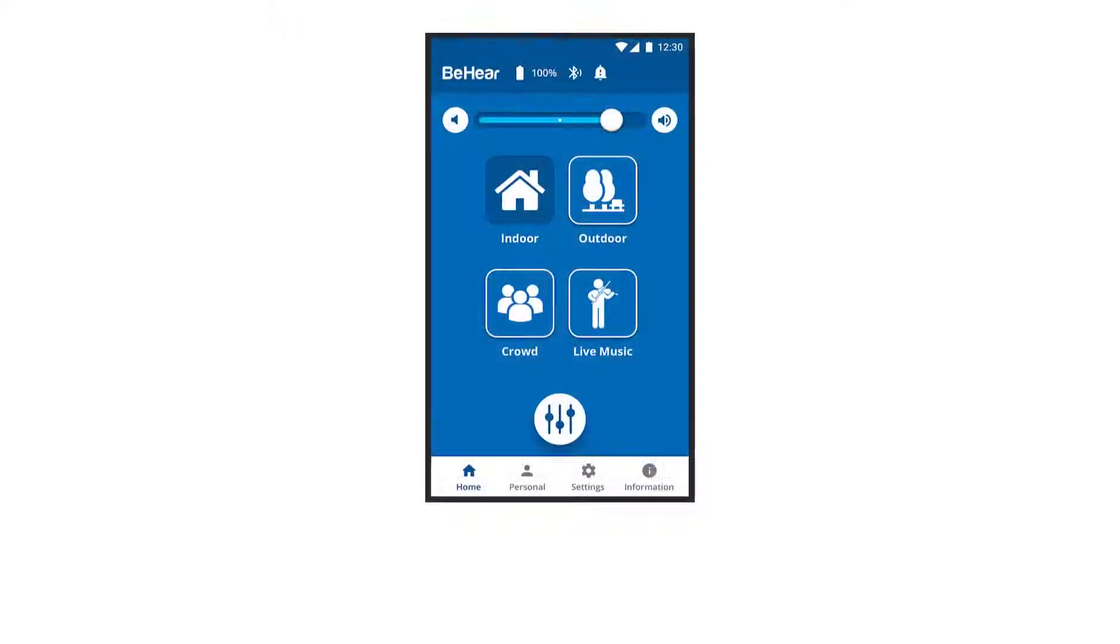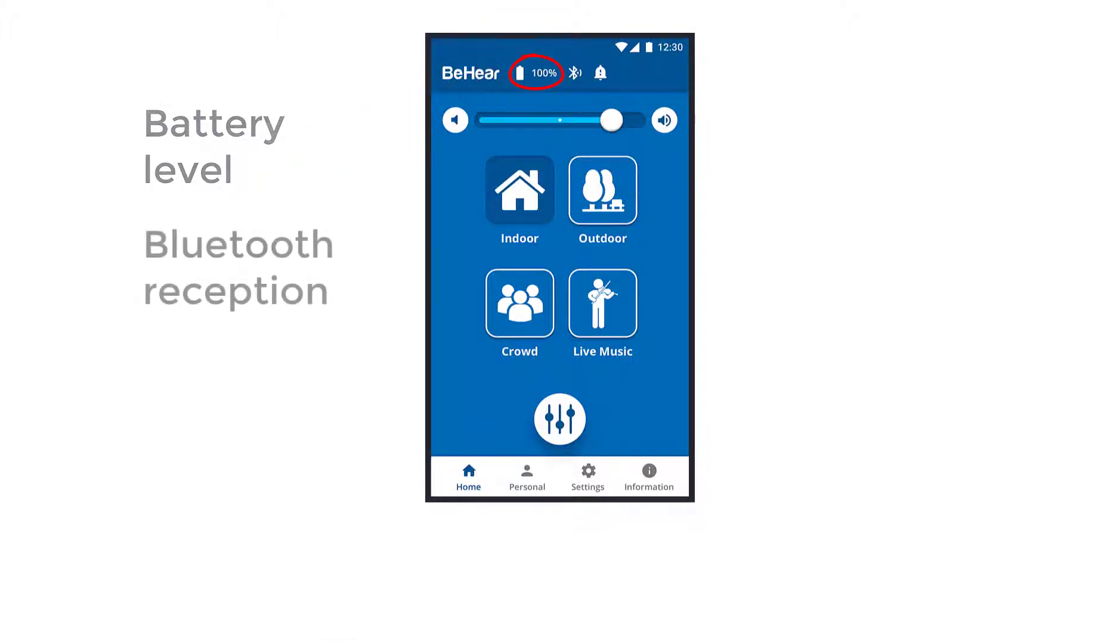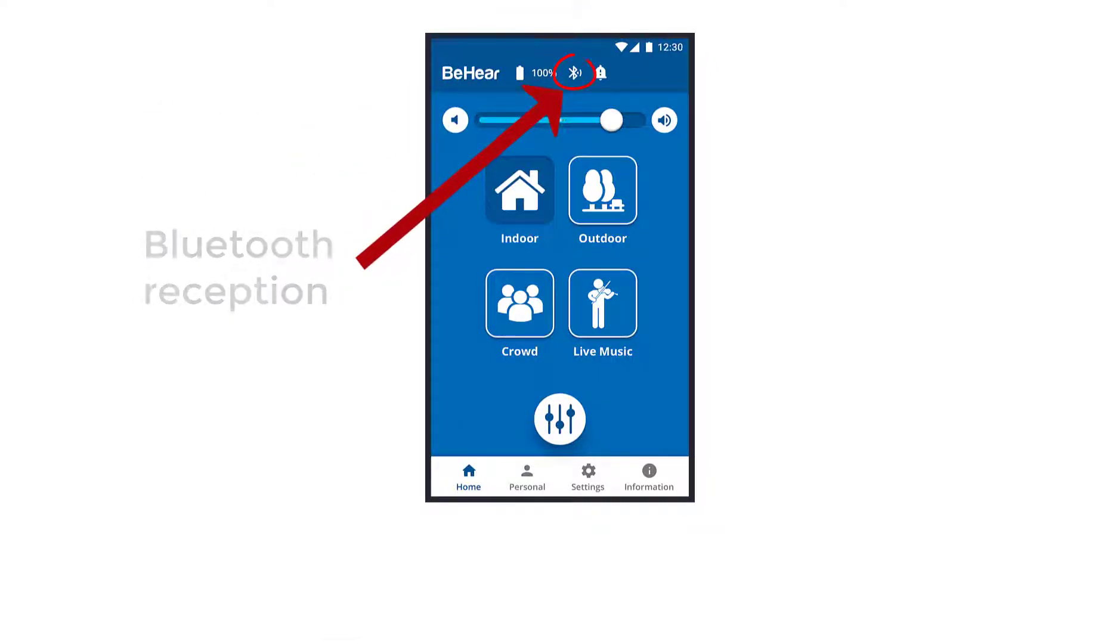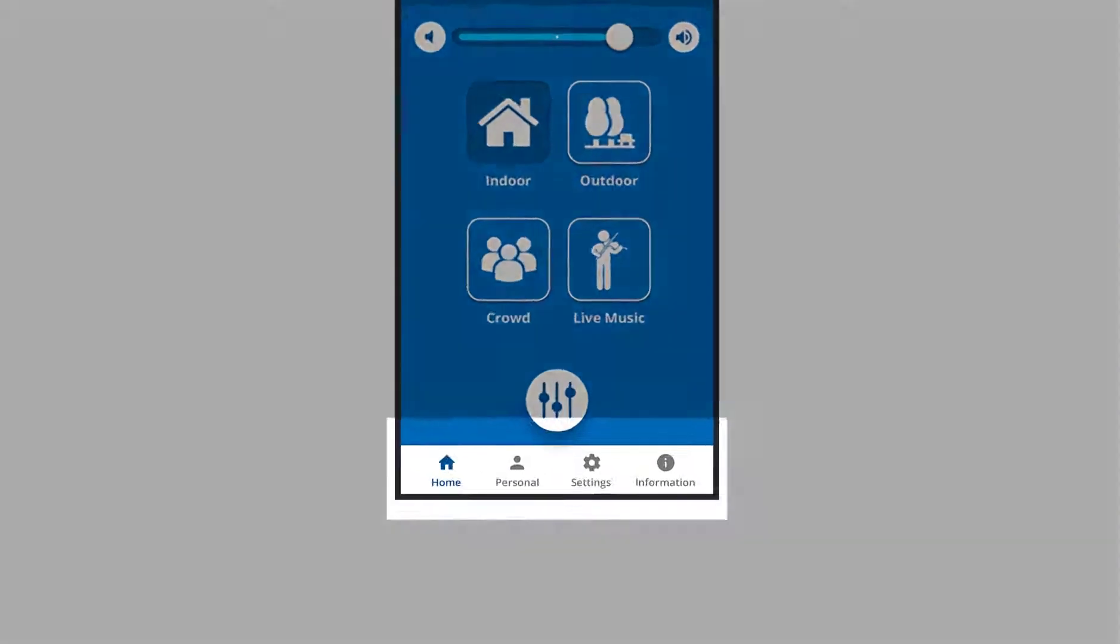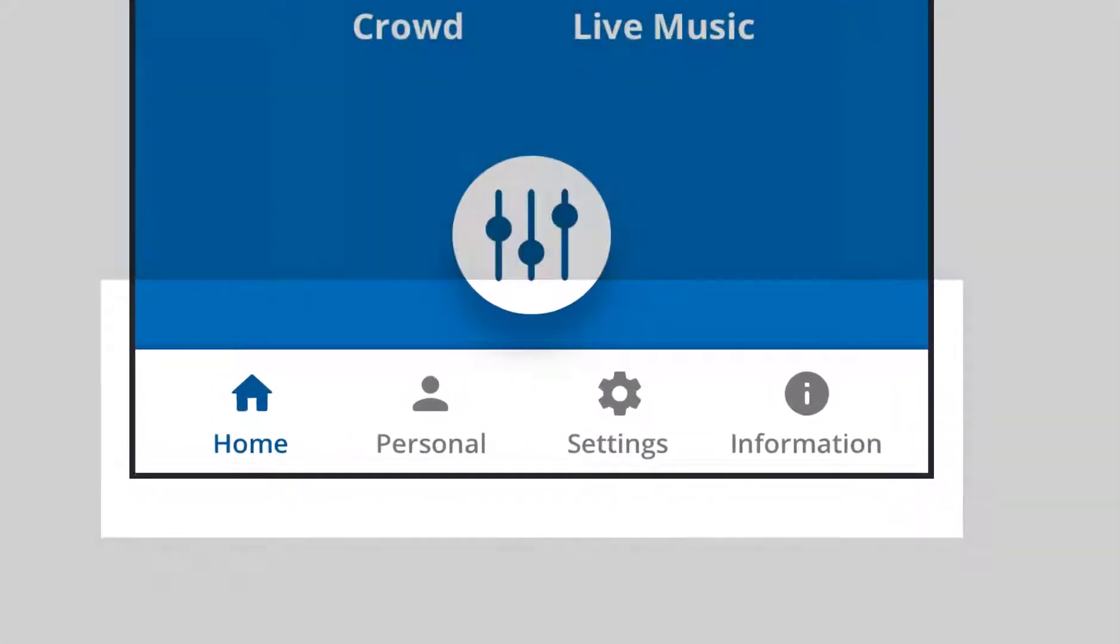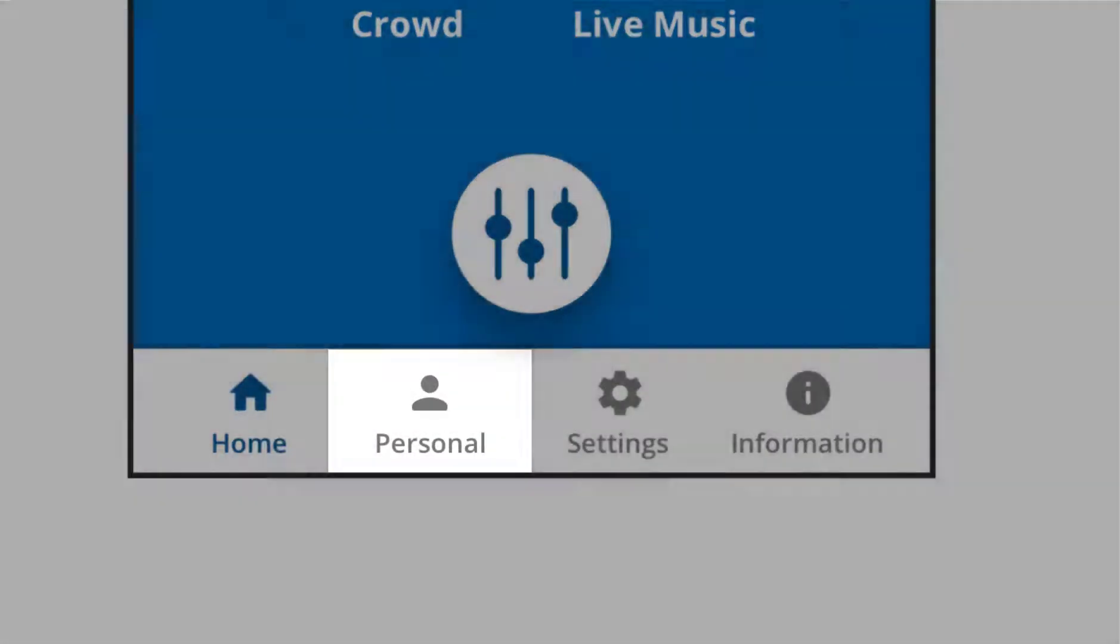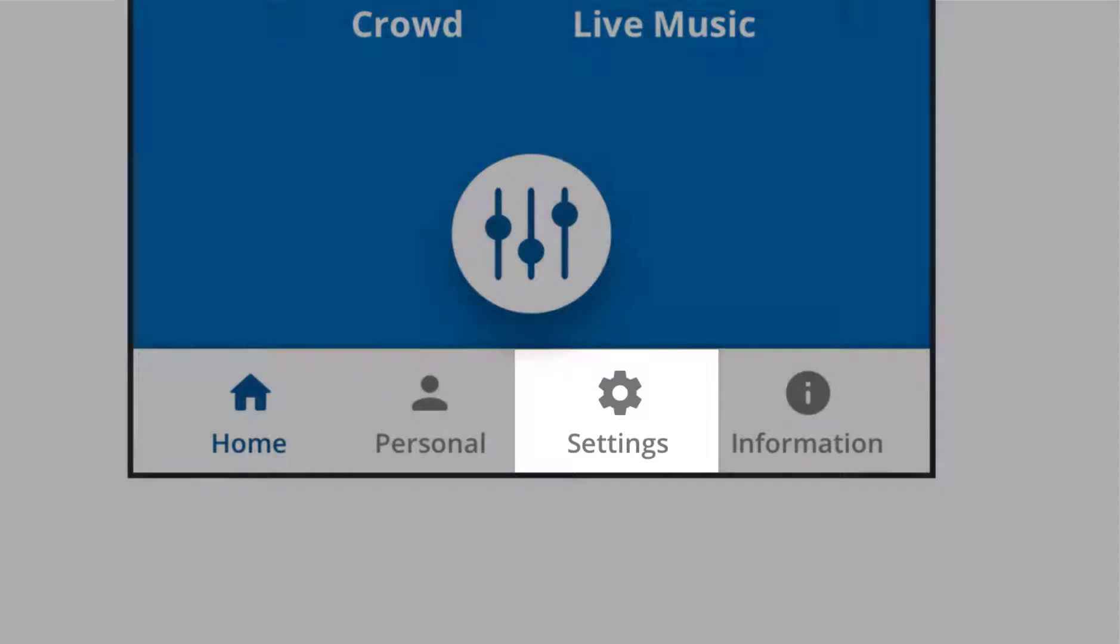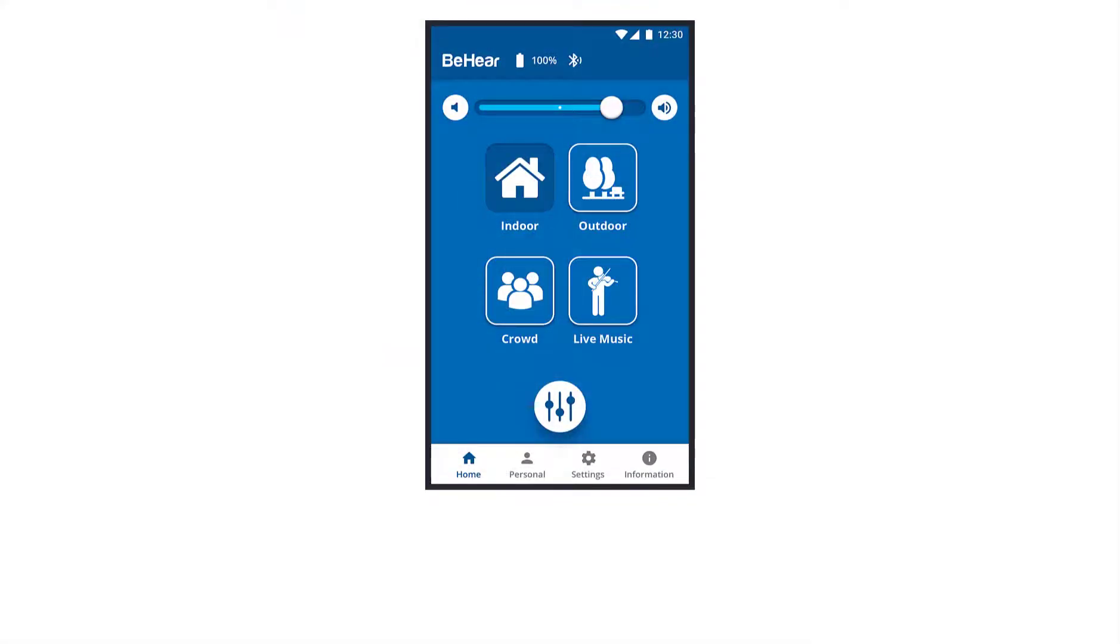In all of the app screens, you can see the battery level here, the Bluetooth reception level here, and new notifications here. Different sections of the app can be accessed using the icons at the bottom of each screen: home, personal, settings, information.